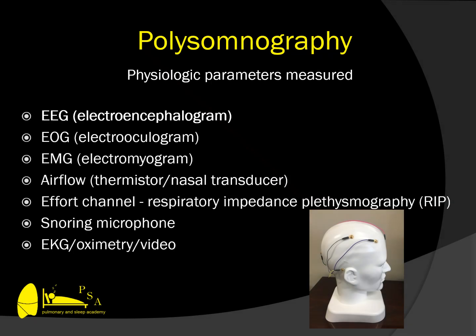The skin is very gently rubbed in the areas where the electrodes are to be placed. It's important for the patient to know that no electrical activity is delivered to these electrodes. They're simply measuring activity in the brain itself. And so there will not be anything uncomfortable about the application of these devices.